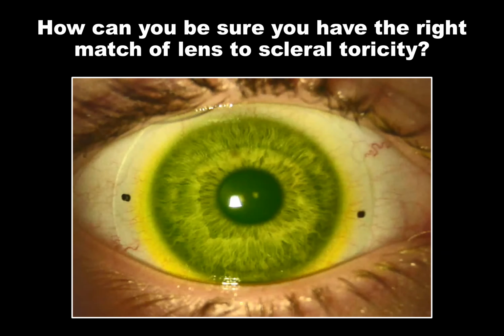Now, conversely, if we stain the front surface of the lens and we notice that the fluorescein is coming in underneath the marker, so near to where the markers are, that means that we have too much toricity. The lens is landing along the steep axis, too heavy, and lifting along the flat axis.